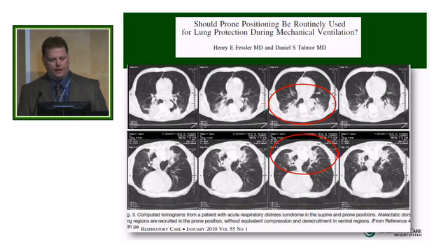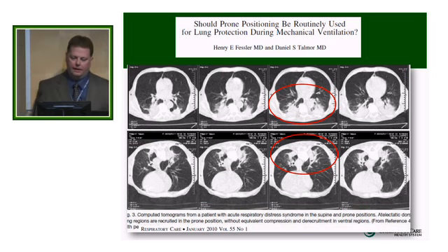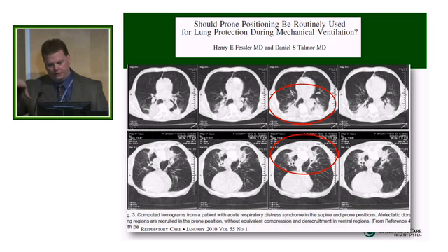You've got this atelectasis and consolidation here, and you see there that it's opened up more. There still is some there, but you certainly see less consolidation, less atelectasis in that region, and that's when you flip that patient over. Now you get the added benefit of some changes in the blood flow, but my opinion, and from what I've heard people say, is that it's probably more of a recruitment maneuver when you prone people than that you've dramatically changed their blood flow when you see those dramatic results sometimes.